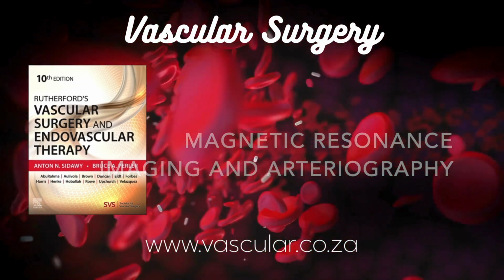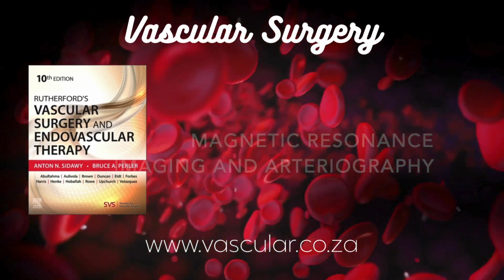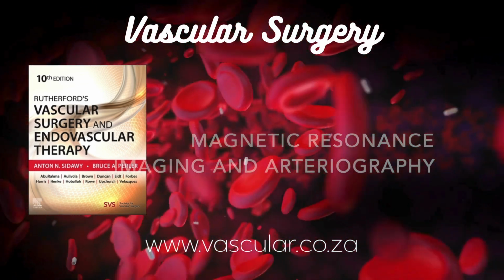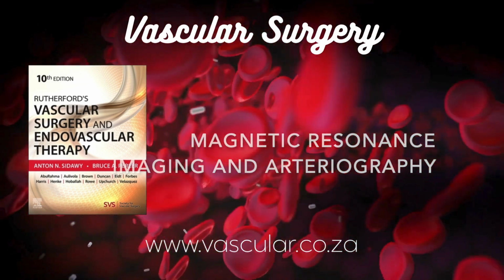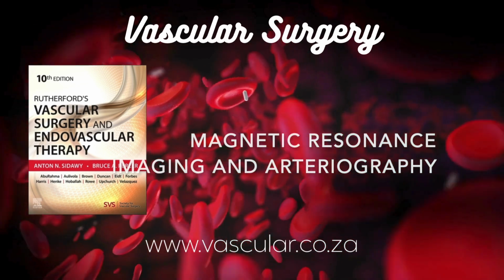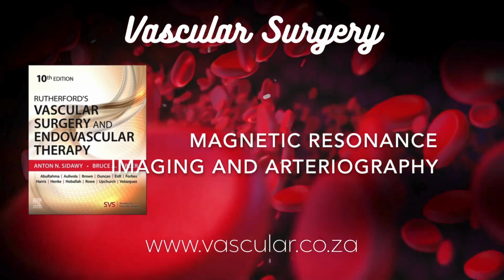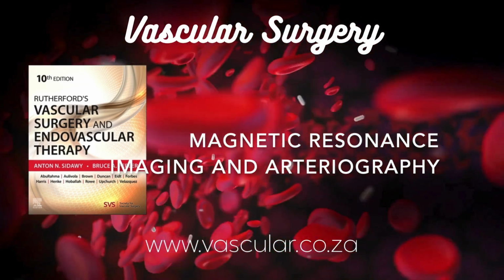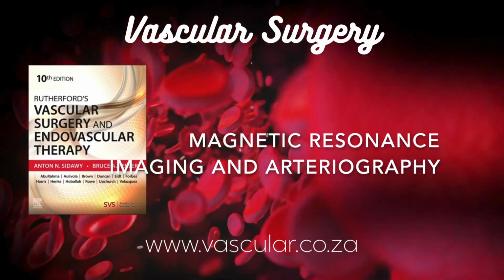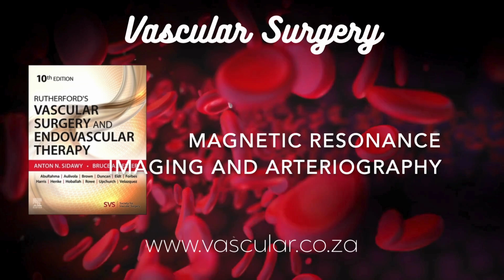CTA resolution is excellent and pretty independent of scan time, but timing the contrast bolus just right can be trickier in CTA, and repeat scans mean more radiation. MRA has no radiation, right? Correct. Big advantage for MRA, especially for younger patients or those needing many follow-up scans. CTA uses X-rays. What about dynamic info? MRA, especially time-resolved MRA, can give you that flow physiology information, though maybe at lower resolution.